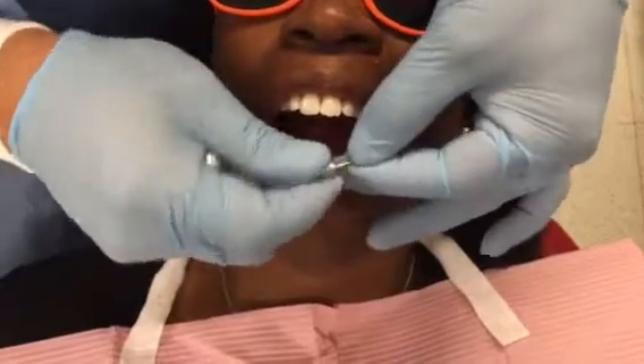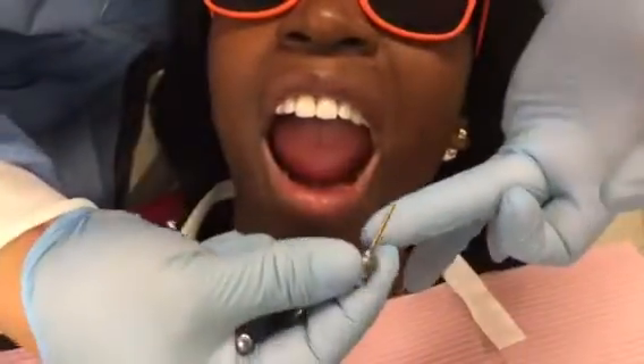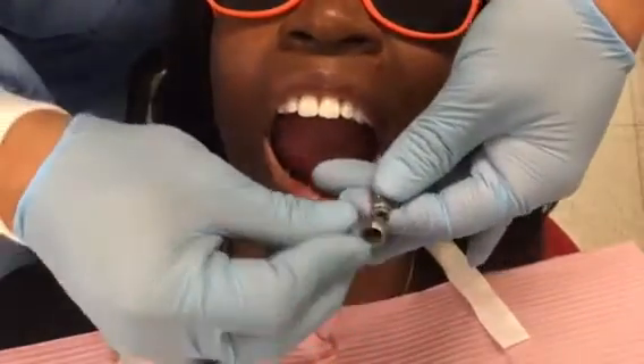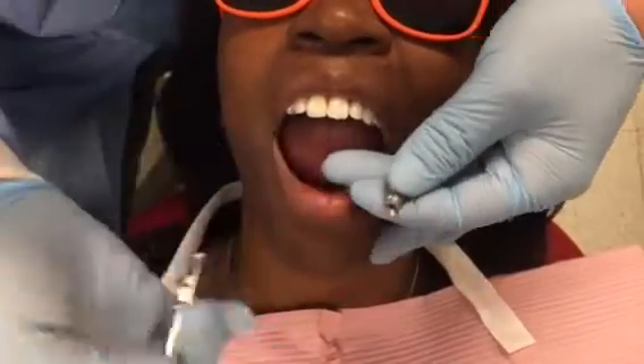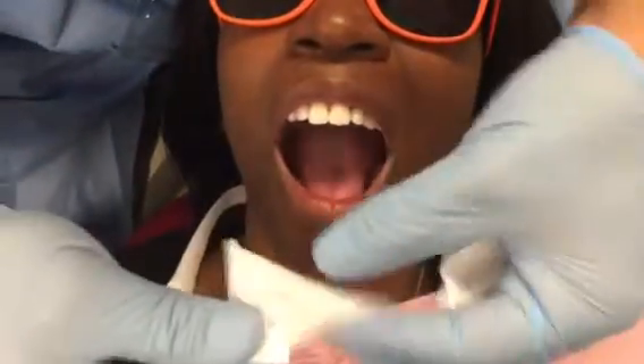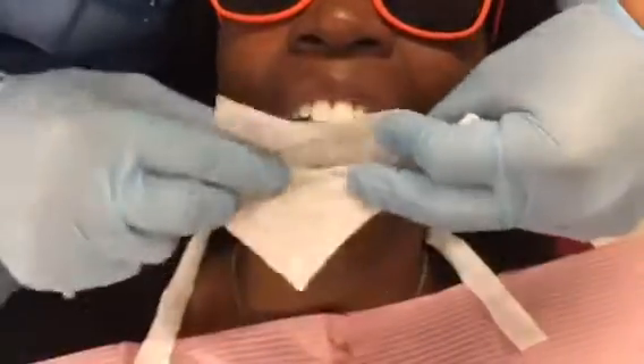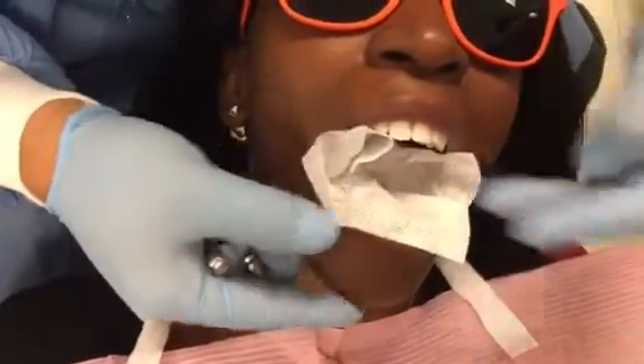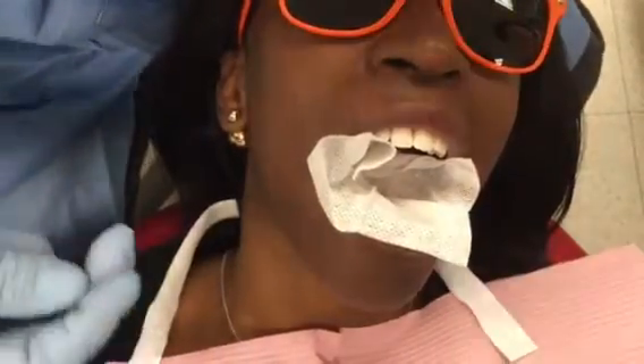I'm just going to make it click here. So once it clicks, normally we use a floss, but if I put a floss it will not fit. So what I'm doing right now is put a gauze back there and ask my patient not to swallow anything that falls. Another trick is to place the patient sideways, so if something falls, it falls to the side and doesn't fall into the throat.